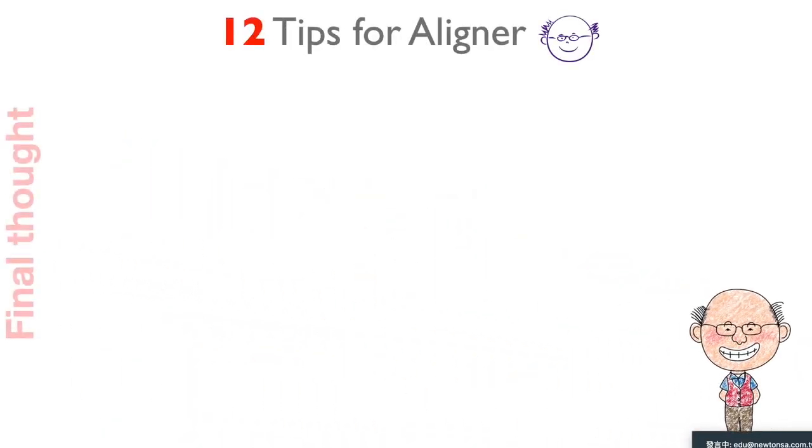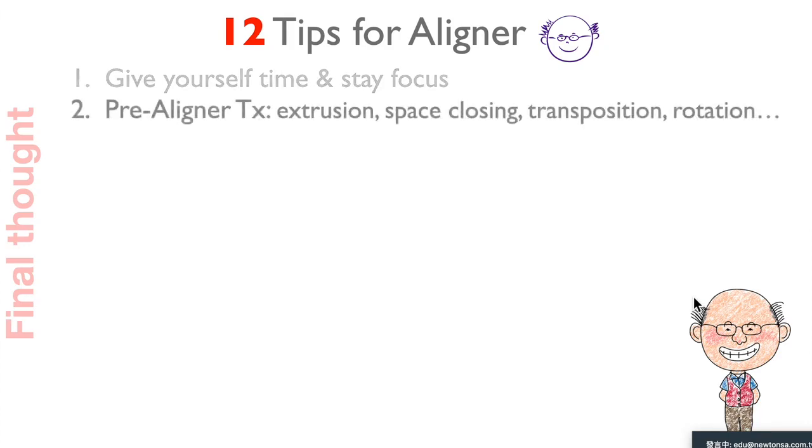First, I list 12 tips for aligner. Number 1, give yourself time and stay focused. You can learn anything, but you can't learn how to use this aligner overnight. It's just not going to happen that way. Number 2, pre-aligner treatment for extrusion, space closing, transposition, rotation. If you find it's beneficial, why not use it? Do not insist on aligner only.